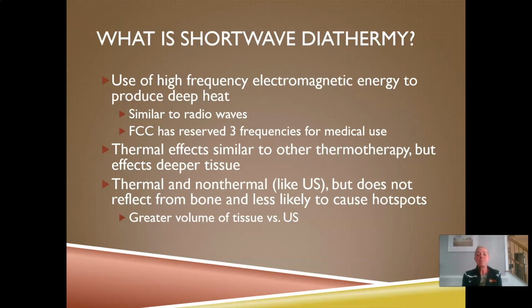It is a type of modality that uses high-frequency electromagnetic energy to produce deep heat. So it's very similar to ultrasound as far as the depth of penetration of heat that it can produce. The electromagnetic energy is similar to radio waves, so the FCC has reserved 3 frequencies specifically for medical use. Again, the thermal effects are going to be similar to the other types of thermotherapy that we've talked about before, but we are going to be able to get to deeper tissue with diathermy. So diathermy and ultrasound are considered to be the deeper heating agents that we have talked about.